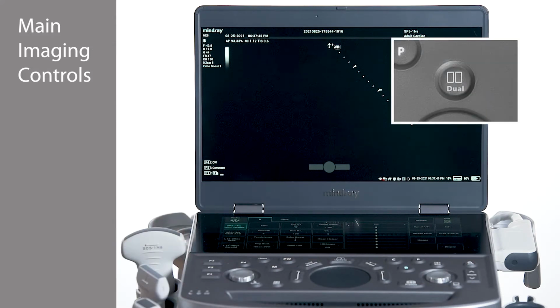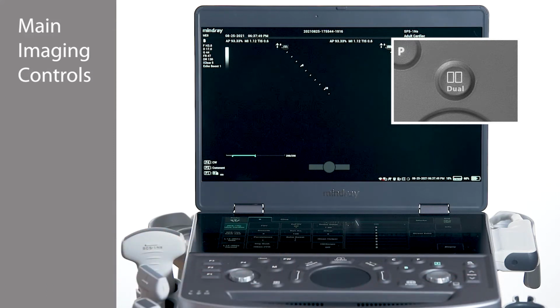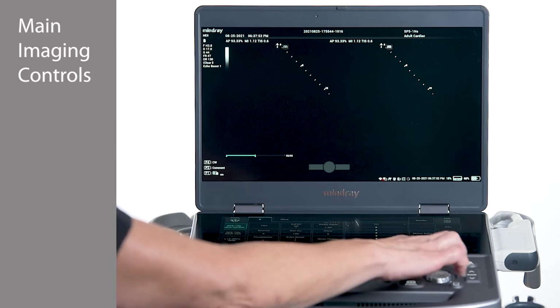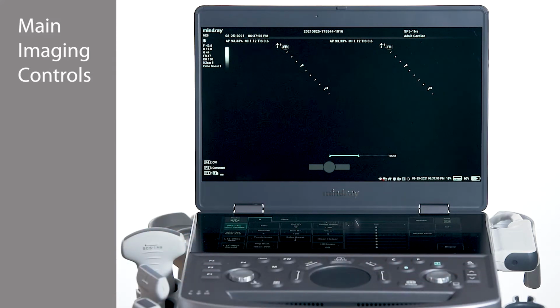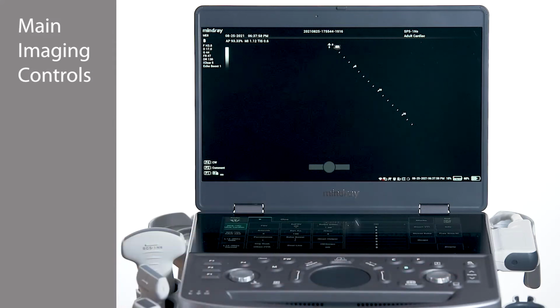To the left of the zoom key is the dual key. When dual is activated, two screens will be displayed. To move between the two split screens, press the dual key again. To exit dual, press the B mode key, which also acts as a home key.